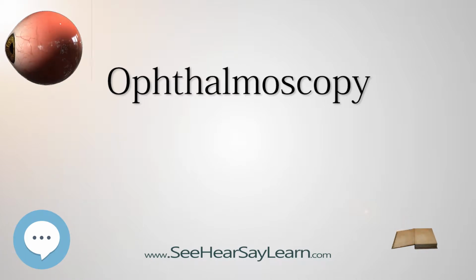An alternative or complement to ophthalmoscopy is to perform fundus photography, where the image can be analyzed later by a professional. Types. It is of two major types. Direct ophthalmoscopy, one that produces an upright, or unreversed, image of approximately 15 times magnification. Indirect ophthalmoscopy, one that produces an inverted, or reversed, image of 2 to 5 times magnification.